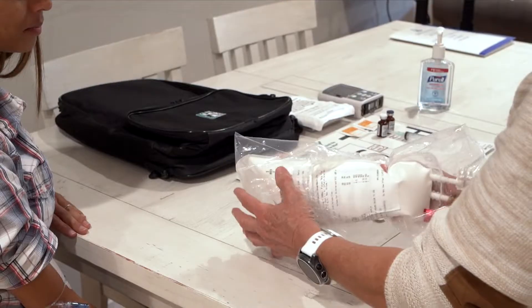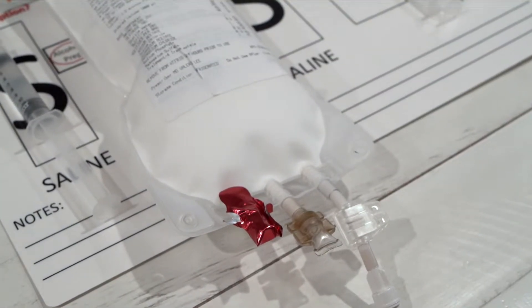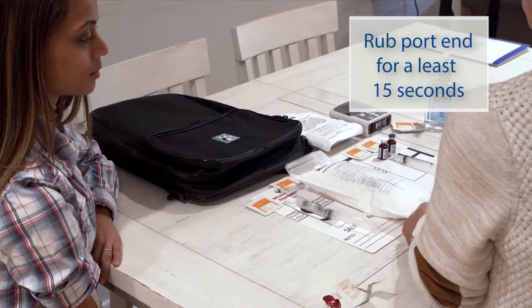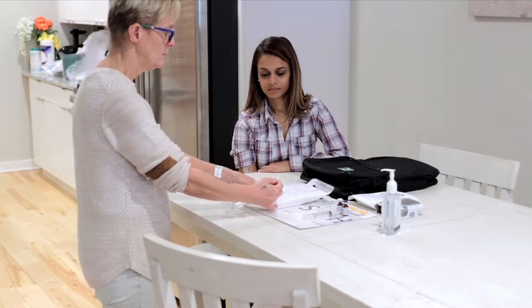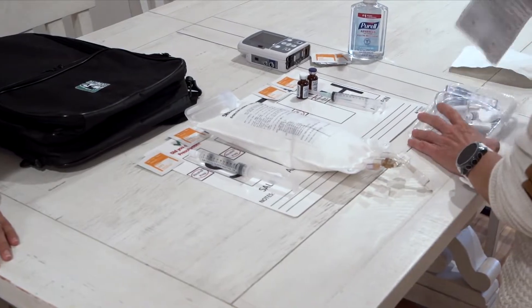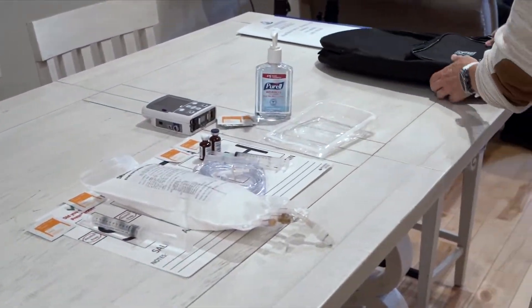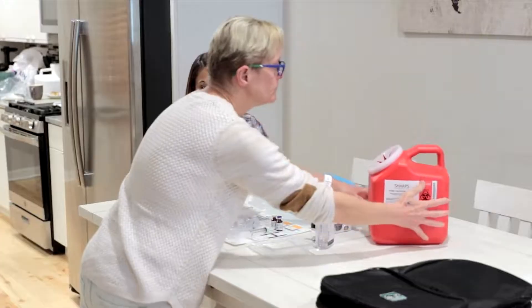If your medication bag is in a plastic bag, remove it from the plastic bag. Find the injection port on the TPN bag — it is covered with tin foil. You will use this port to inject any additives into the TPN. Remove the foil and rub the port with an alcohol pad for at least 15 seconds. Place the unwrapped medication bag above the A of your mat. Put a clean alcohol pad under the port to protect it from recontamination. Locate the tubing and remove it from the wrapping. Remove the white tape and the blue clip from the tubing. Keep the clear plastic wrapping to the side. Place the tubing with your TPN, and the carrying bag to the side. Place the trash bag close by and the sharps container within your reach. Wash your hands.